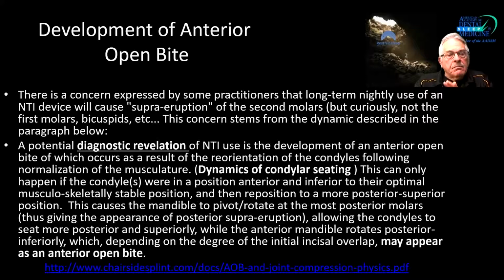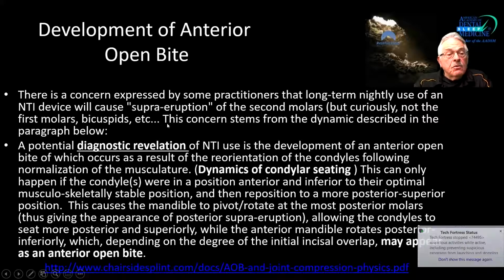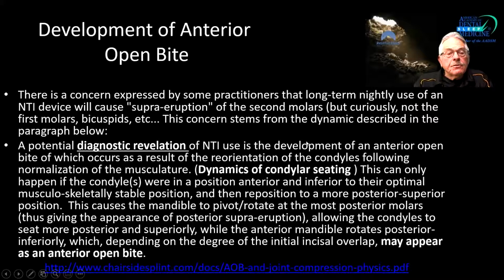But we're still on this anterior open bite thing, because some people think that it intrudes anterior teeth. Some people think that posterior molars erupt, and neither of those are true. So there is concern expressed by some practitioners that long-term nightly use of an NTI device will cause supra-eruption of the second molars, but curiously, not the first molars or the bicuspids, etc. This concern stems from the dynamic described in the paragraph below. This is some work from James Boyd.